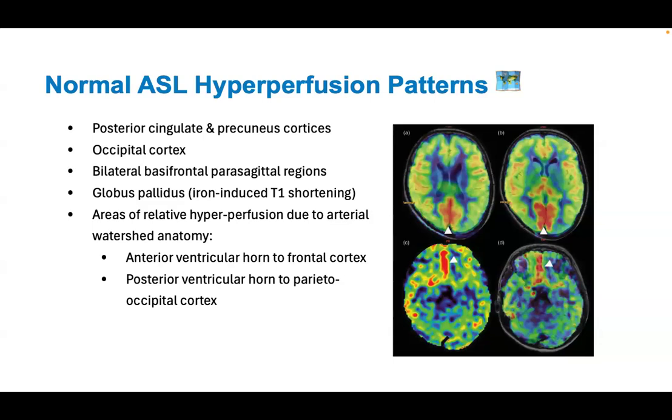SISCOM, subtract. The same thing, if you do it with ictal and interictal ASL, may not work. It may not correspond with the SISCOM. May or may not, depending on when you catch it.